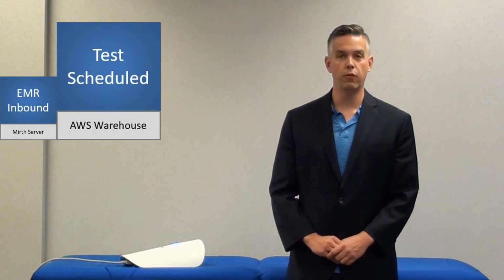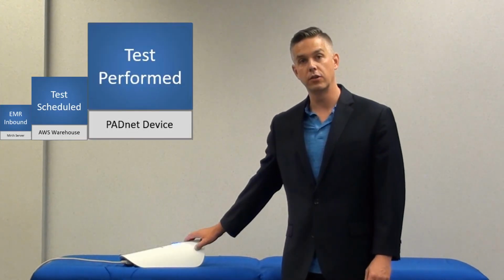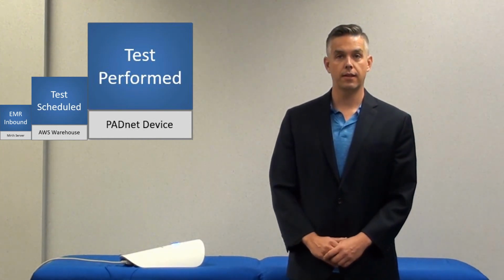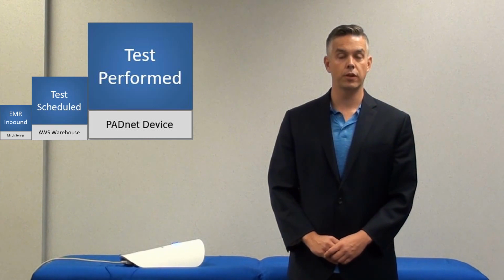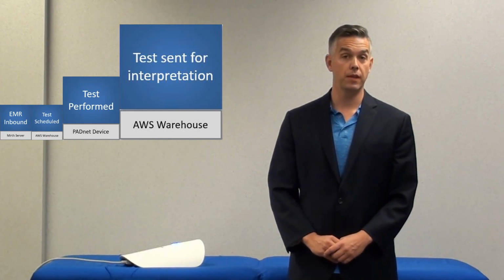Once the test is performed, the data is then sent back up to the cloud from the PADnet DTU, or Diagnostic Testing Unit. And that test can be used in a number of different ways. Typically, a vascular specialist will interpret that study, and the study interpretation can be sent back to the PADnet user, who would then access it through the Remote View website.